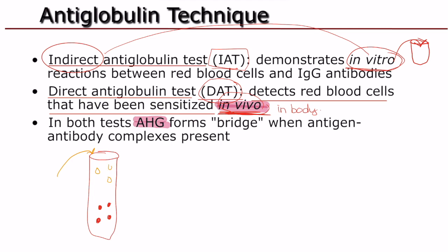And in this plasma, let's make a bigger picture here. There's our bigger drop. We have lots of antibodies in this plasma. And oh, there's our beak for our chickenpox one. That's actually not what we're looking for in blood bank though, but they're in there because it's plasma. There's all sorts of things in the plasma.